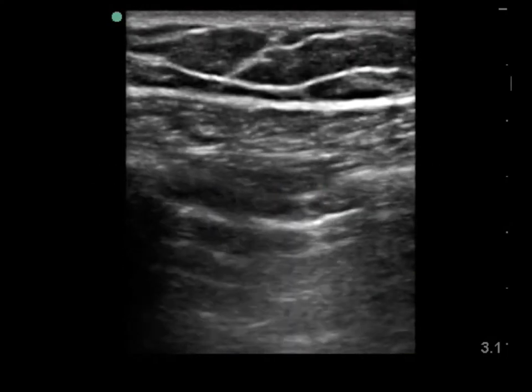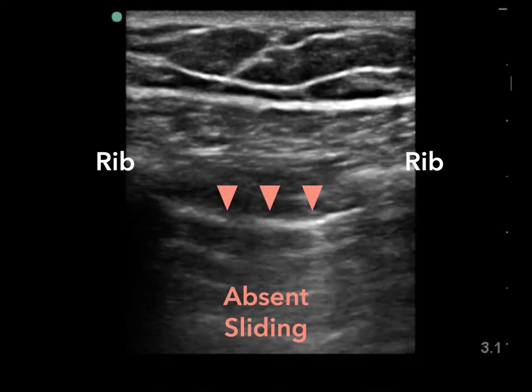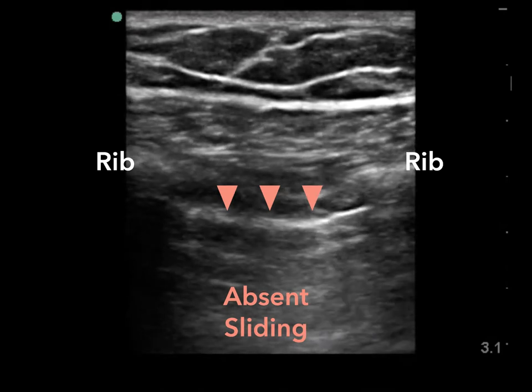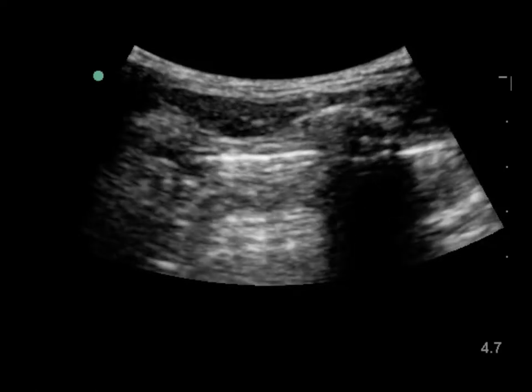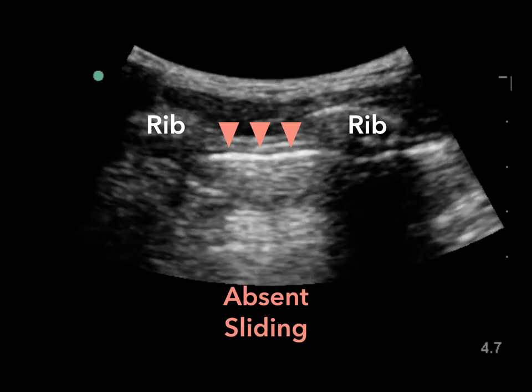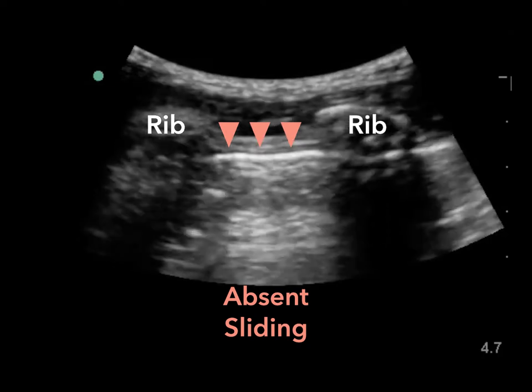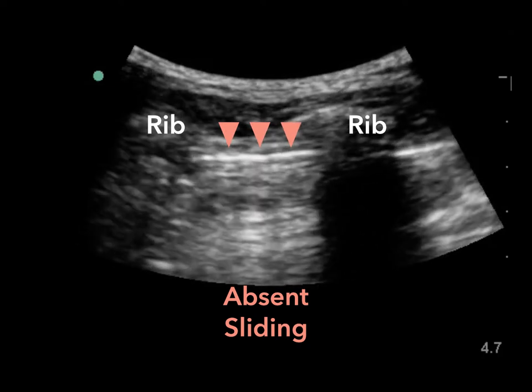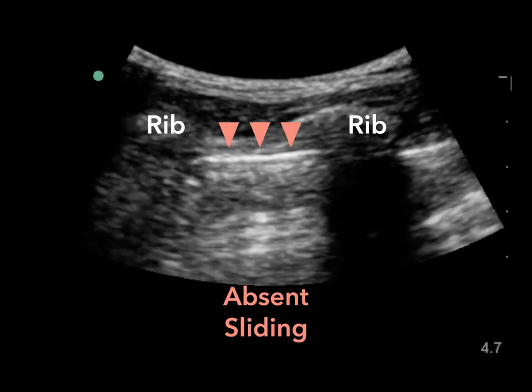Here we see ribs, but this pleural line does not appear to be moving. This is an absence of sliding and suggests that the visceral and parietal pleura are not in contact with each other. Here's another example using the curvilinear probe — we see ribs and a bright white pleural line that does not seem to be moving. This should make you suspicious for the presence of a pneumothorax. However, you can also have absence of sliding if you're scanning over a large bulla, or if a patient has had a main stem intubation with an absence of ventilation in the lung you're scanning.